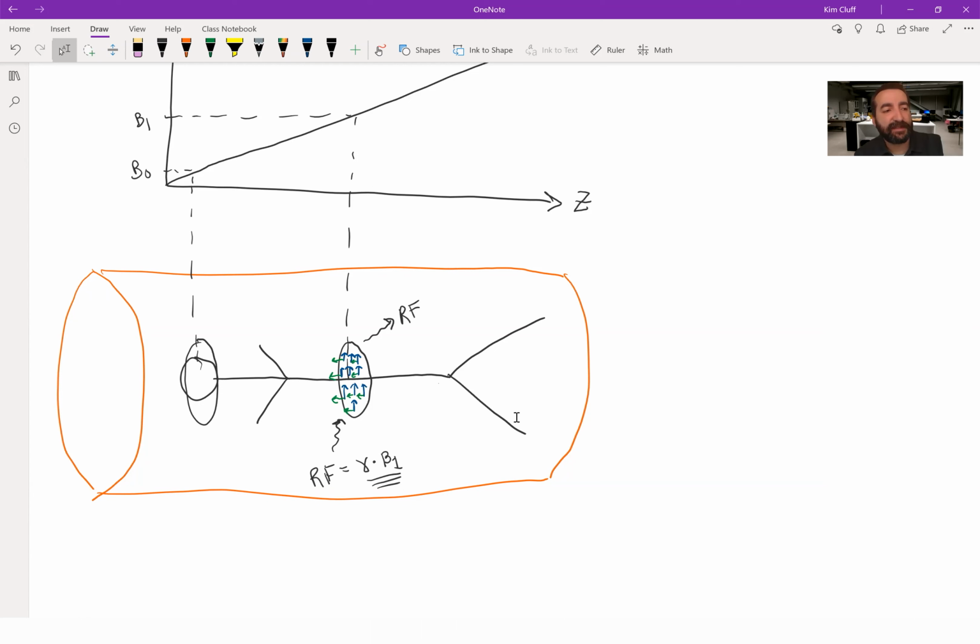Well, you can inject the patient with something that has a different gyromagnetic ratio. And then you could see where the hydrogen atoms are and where this fluid is that you injected, this contrast agent. Oftentimes this is done when you want to see something that maybe doesn't have a very strong MRI signal. Or if you want to see blood or different things in the vasculature.